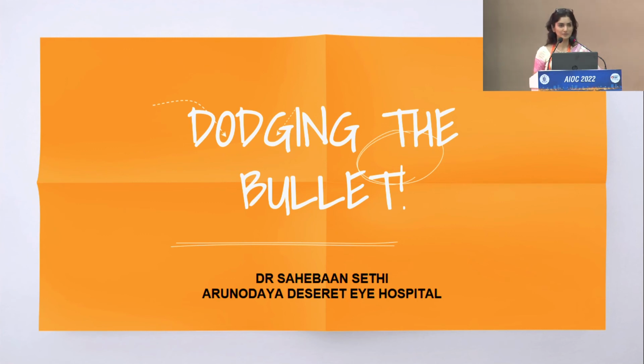Surgeons who are comfortable with SICS don't need phaco as their backup surgery, and believe me, I've been attending talks wherein people have been placing multifocals and toric IOLs with an SICS surgery. So it's not just a checklist box that you tick in your post-graduation, just to finish those 12-15 cases of SICS so that you can move on and learn phaco. It's very important to be good at SICS, because it will only act as your backup surgery if you're good at it and confident with it.